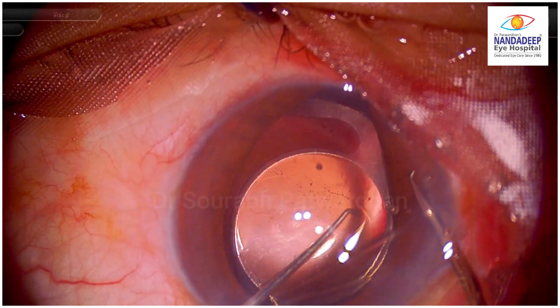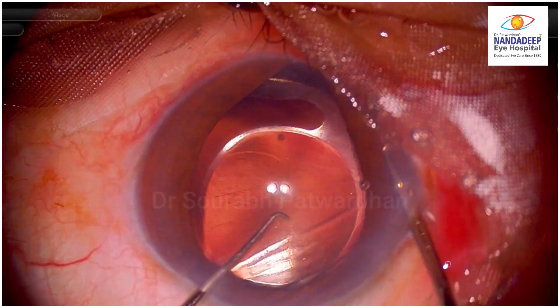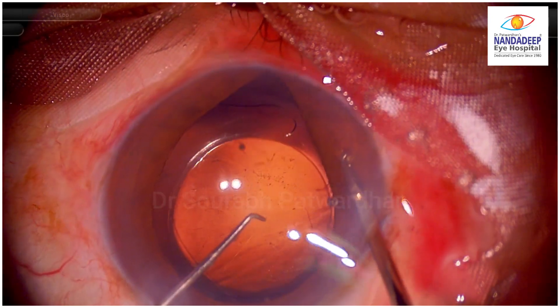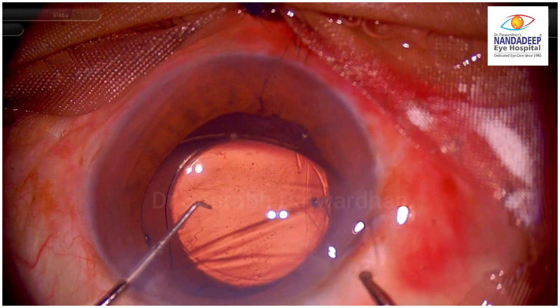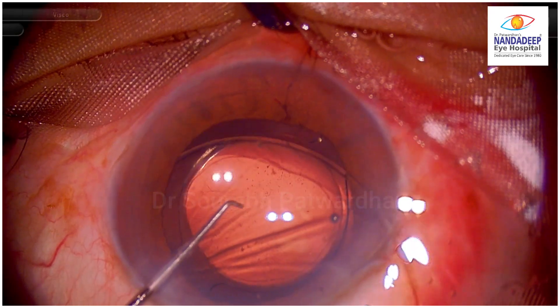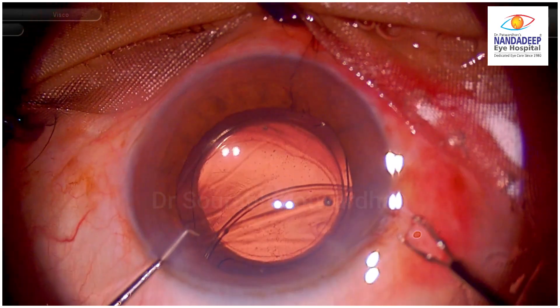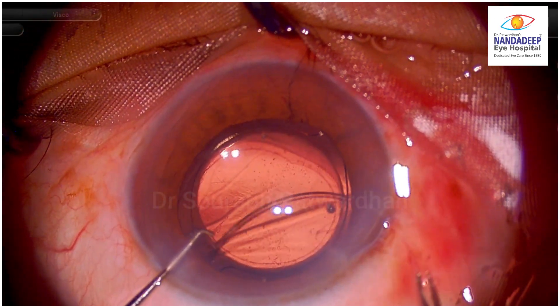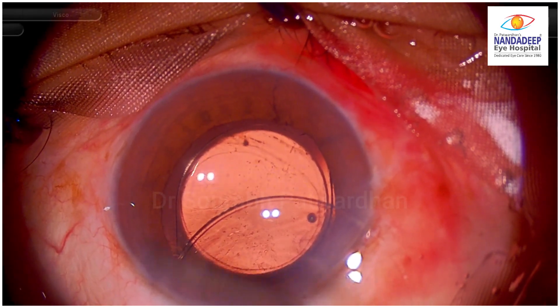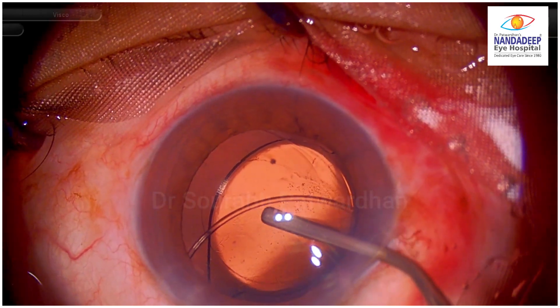Now I can see the eyelet and I try to hold the eyelet with the micro grasper. The first thing I am going to do is pull the CTR out from the bag completely so that I will get the chance to re-insert it again into the bag. You can see that almost more than half of the CTR was not in the bag. Inflate the anterior chamber and make it deep — do not try to insert the CTR when the anterior chamber is shallow.